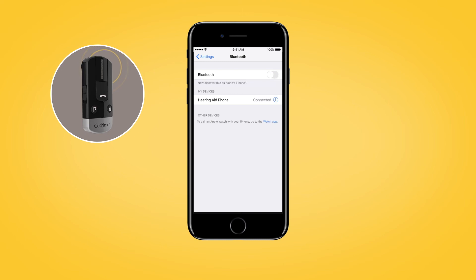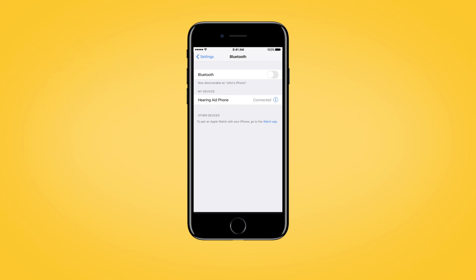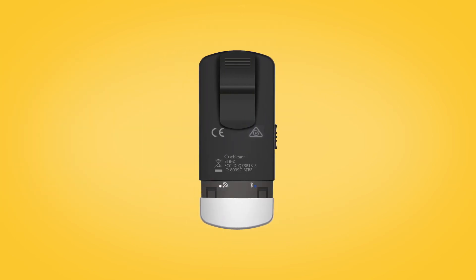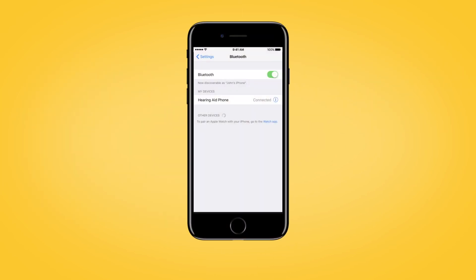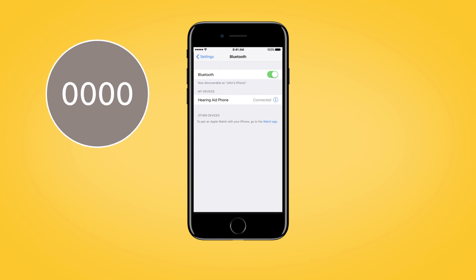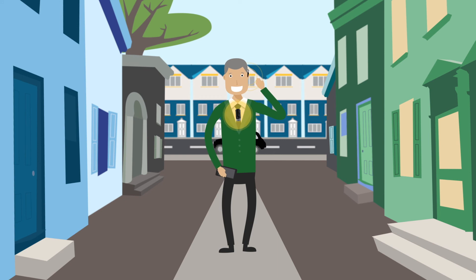To pair your phone clip to your mobile phone, make sure that your phone's Bluetooth function is switched on. Remove the silver cap and press the pairing button on the back to activate pairing mode for two minutes. During pairing mode, the LED will turn blue. On your mobile phone, search for new Bluetooth devices and select 'Hearing Aid Phone' from the list. If your mobile phone asks for a passcode, enter four zeros. Your phone clip should now be paired with your mobile phone.